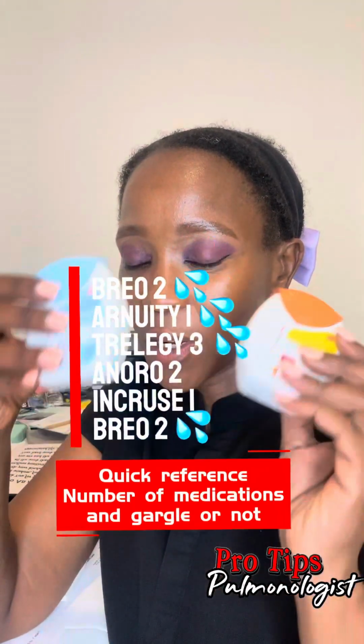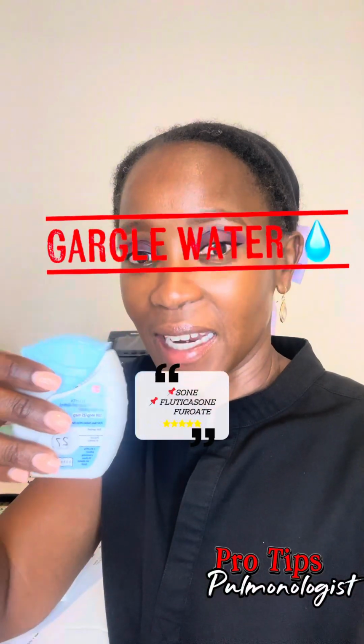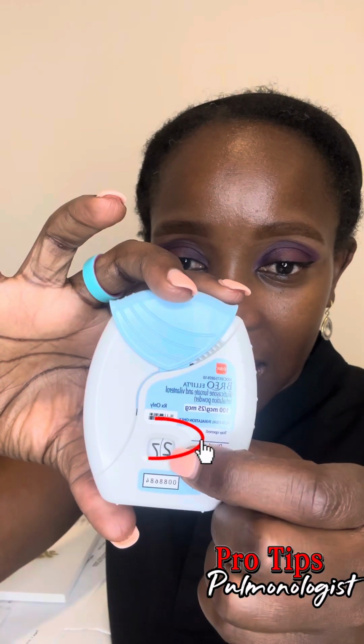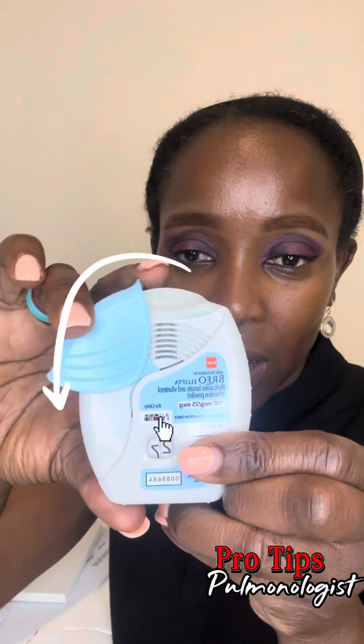Why do you have to rinse? Because they have a steroid inside. Fluticasone is inside here. You need to rinse off. See the number there? It's going to go down. Do not take your device and tip it over, because then your powder will fall out. You can look and see it right there.